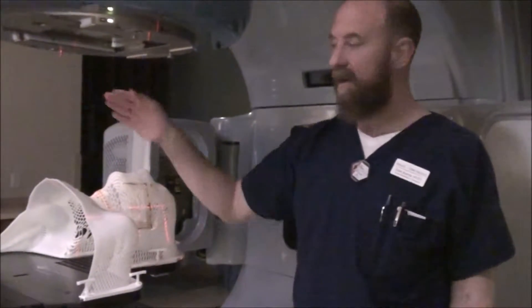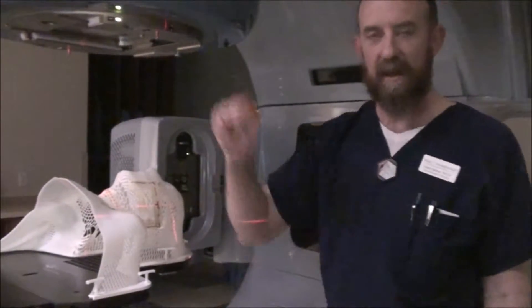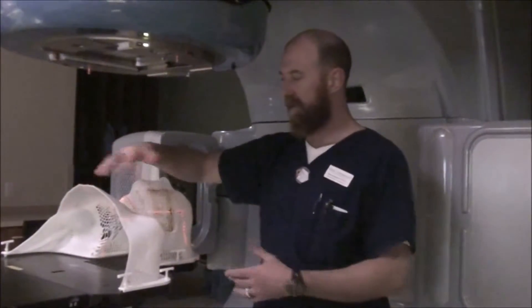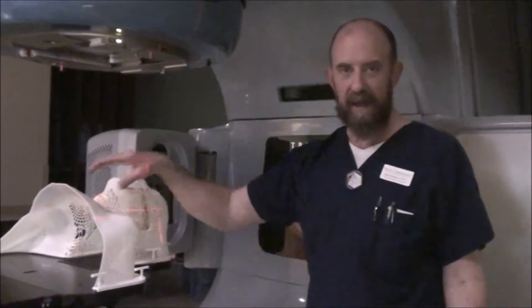Now we've got our match line on there, radiographically showing you exactly where that match line is going to be. Take your x-ray, get it approved. Once it's approved, document everything, come in, mark your CR — all the same stuff you did before. That wire and taking the film first is really the only difference between the mono-ISO and the non-mono-ISO. Where the big difference comes in is when we go to the lateral.